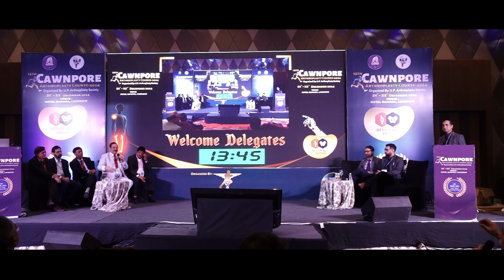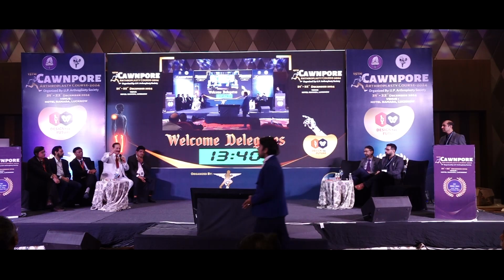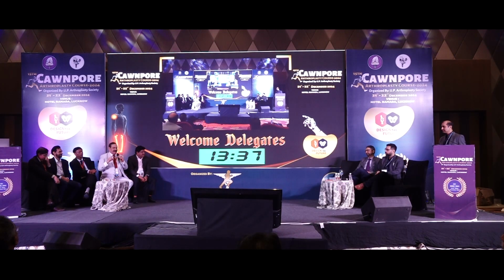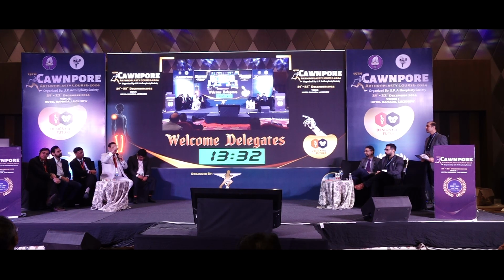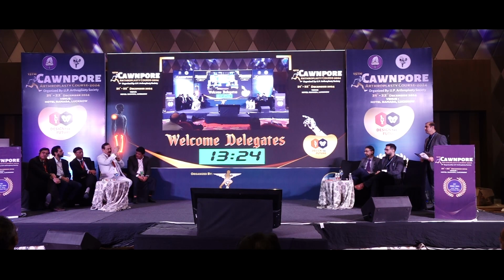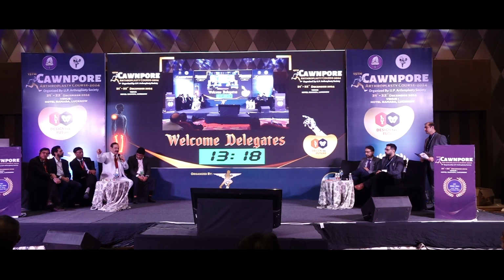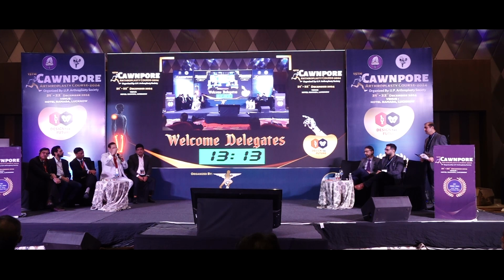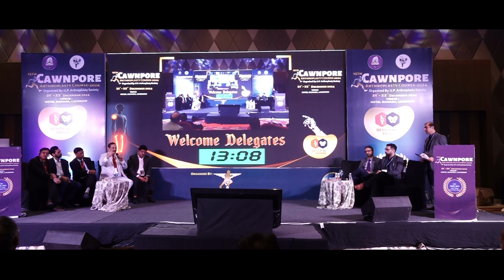How to replicate on the table? There is something called, Dr. Tripathi, mental templating, what I do. Mental templating is, before surgery, see the X-ray extremely carefully, and whatever is visible, the lateral most edge of the remaining acetabulum, I'm talking about the protrusio side. Either you template or have mental templating, make your diagram a horizontal bar, 45 degree, and you understand before surgery how much cup will come outside that margin. And a similar thing you reproduce on table.